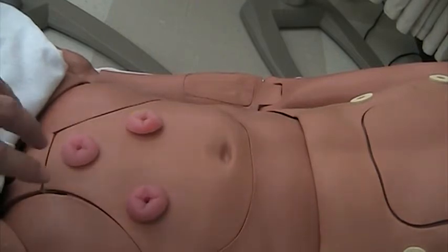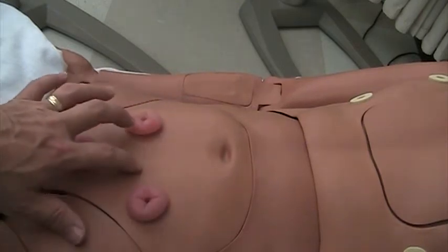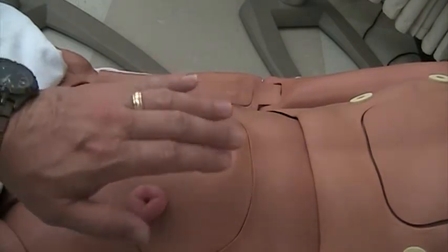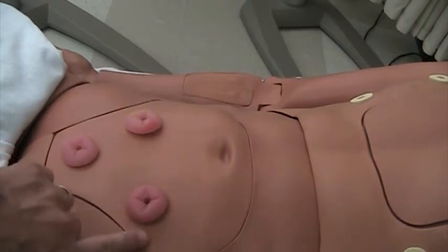Okay, so when we are actually trying to measure what size pouch, let me back up a step. You have to have something that covers this securely, so that you can have a pouch to capture the feces, or else it would always leak. It would leak right onto the patient's abdomen.